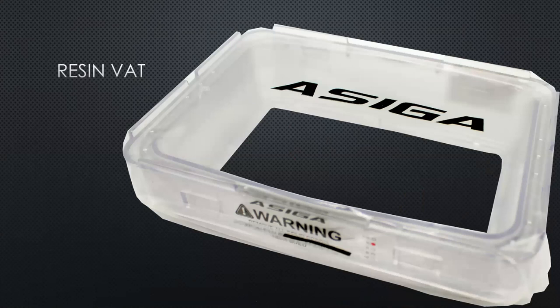The bottom of the resin vat on traditional DLP printers consists of a flexible membrane. The reason for this is the resin is partially cured during the exposure, and it is then peeled off of that flexible membrane by the build platform. Because this membrane experiences a lot of wear and tear as a result of literal tearing of the 3D printed parts off of it, the resin vat in most printers is considered a consumable item, and it needs to be replaced pretty regularly once it's reached the end of its life expectancy.